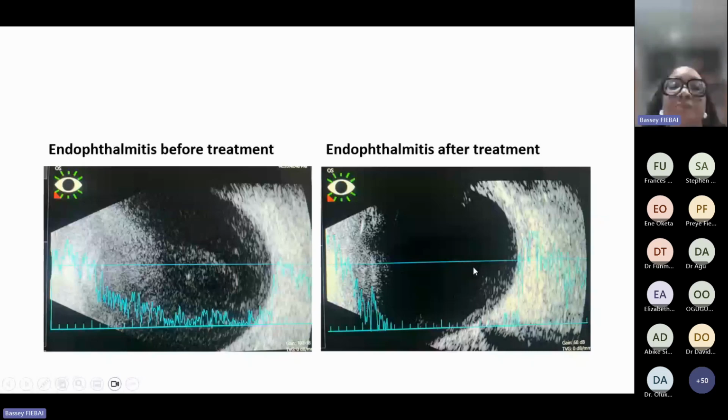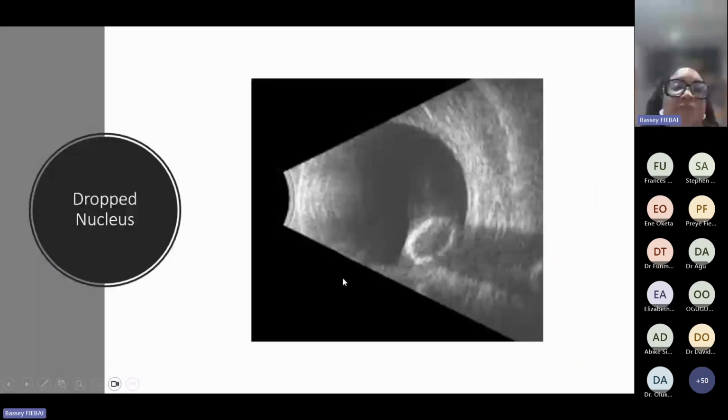This is a picture of an echogram of a dropped nucleus. It's very classic. You would describe this as a hyperechoic mass in the vitreous, and if there were to be an A scan over it, you will see very high spikes. You're also able to appreciate the location. This is sitting pretty on top of the optic nerve head. This is the anechoic optic nerve. You can see that the echo strength here is much, much brighter than what you have here.